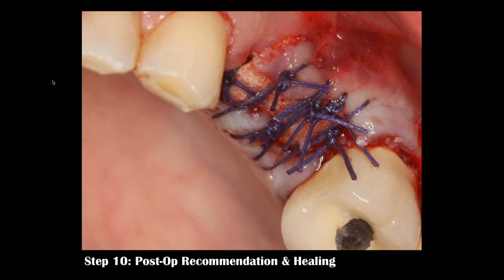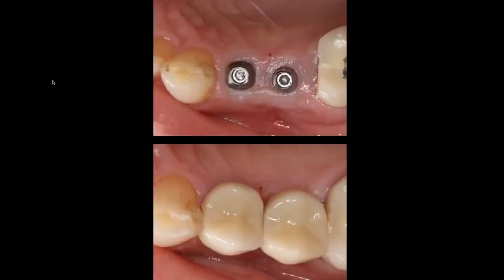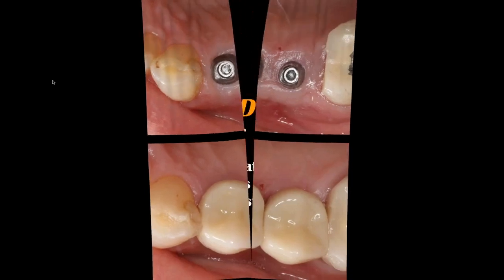That's okay — epithelium will grow from half a millimeter to a millimeter per day and will cover over very nicely in a short time. In four months I expose and take my impression. Here I made custom titanium abutments with margins at or slightly subgingival, and two bruxer crowns to restore function to our patient.